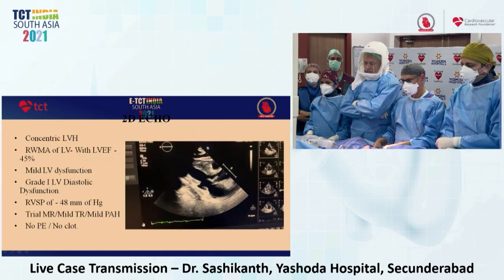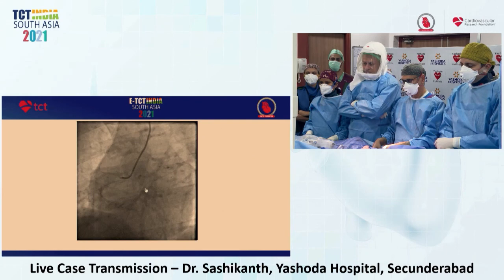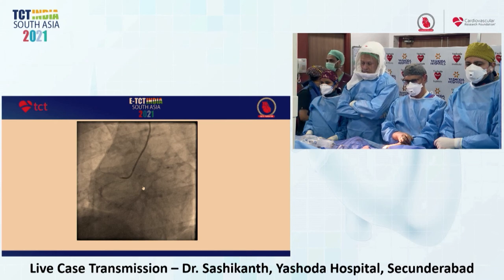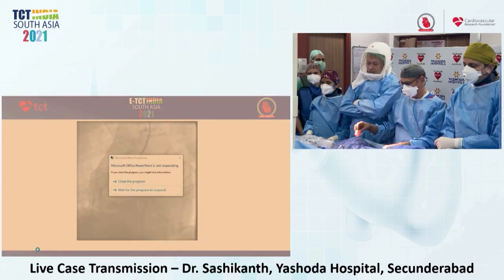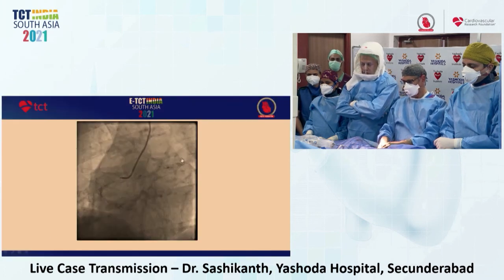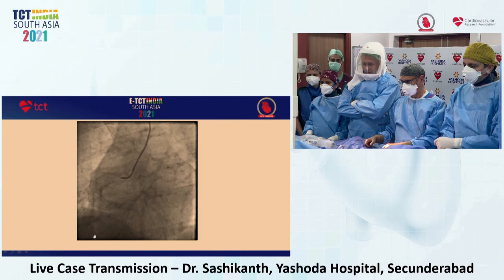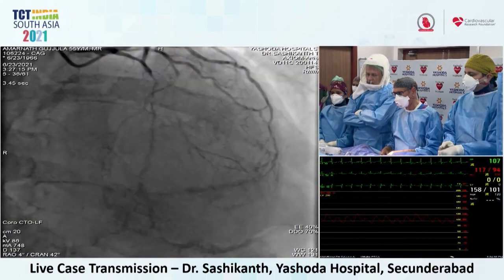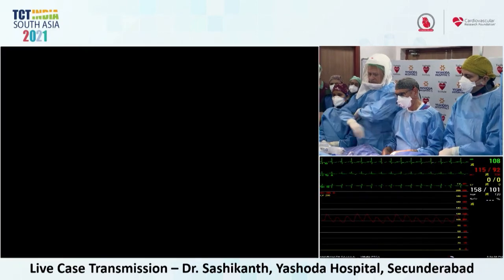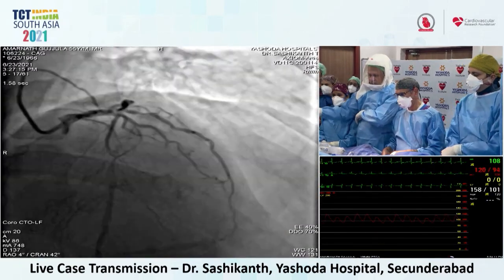This is the angiogram. Can you play the angiogram? You can show today's pictures otherwise. No, the concept today is zero contrast PCI. So we are showing you the recorded PCI there. Can you see the images now? Yes. Okay, previous scene.